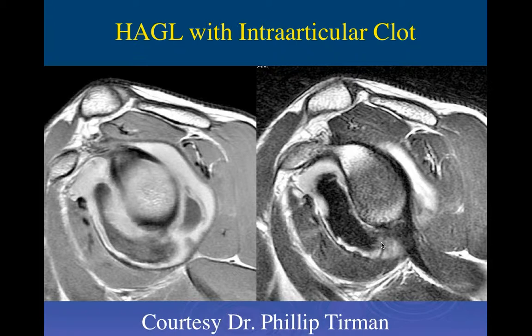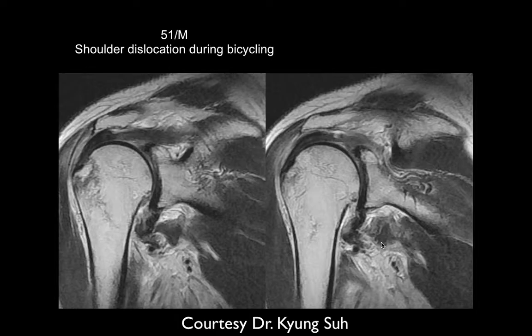So here's a 19-year-old with a hyperextension injury playing badminton, and again we can see the inferior tear here of the capsular attachments. Quite a badminton game. A lot of other injuries.